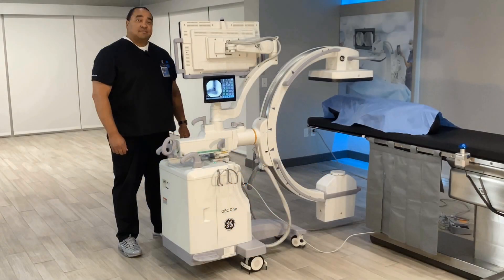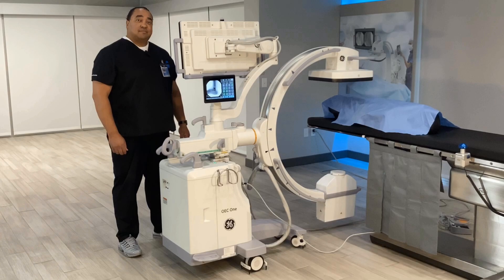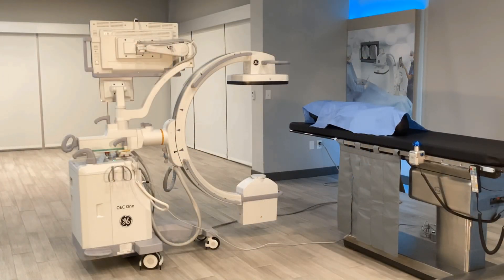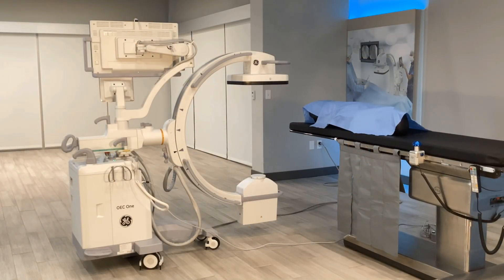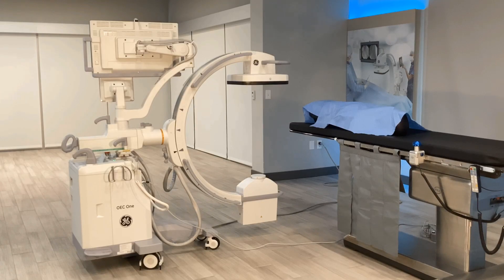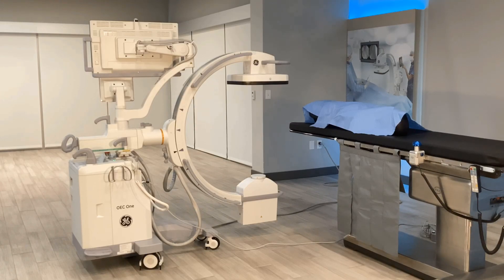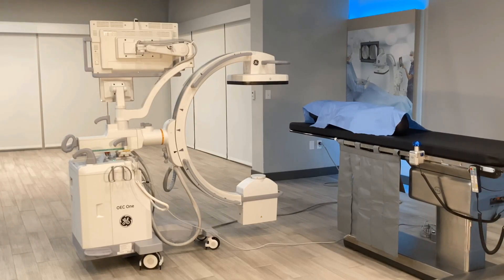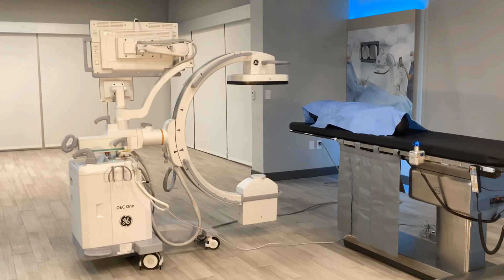Hello, my name is Kevin Paul and I am a Clinical Imaging Specialist with GE Healthcare. And I am Allison Cook. This video will review general usage of the OEC 1 CFD C-Arm — case support start to finish.